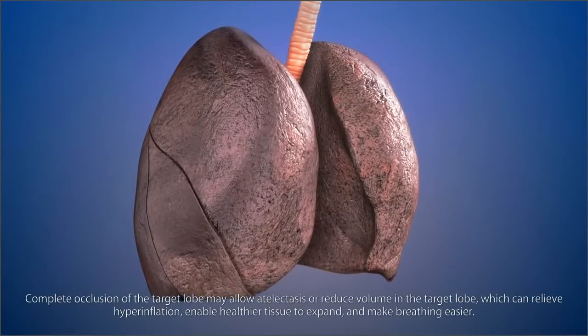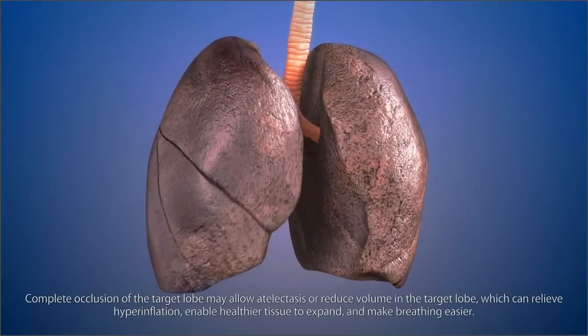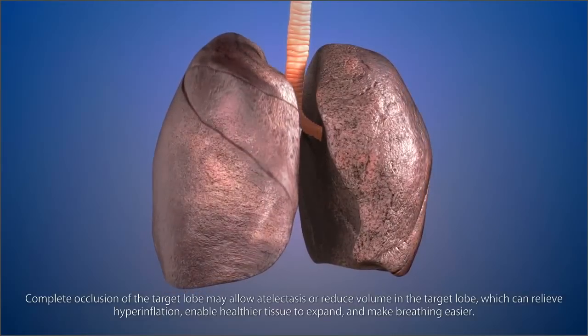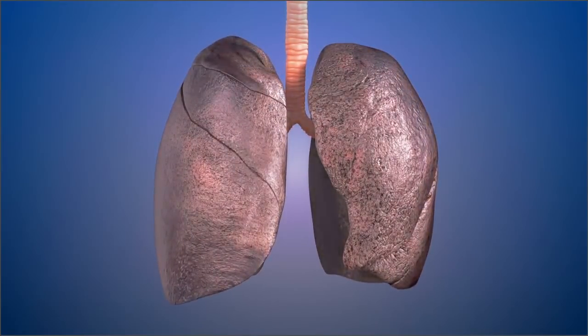Complete occlusion of the target lobe may allow atelectasis or reduce volume in the target lobe, which can relieve hyperinflation, enable healthier tissue to expand, and make breathing easier.